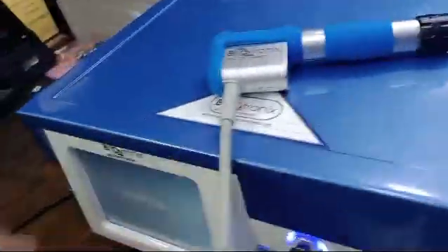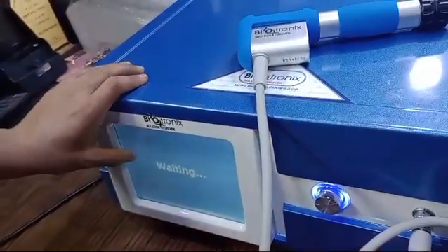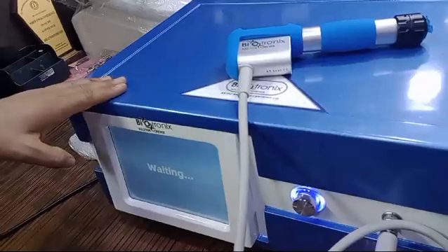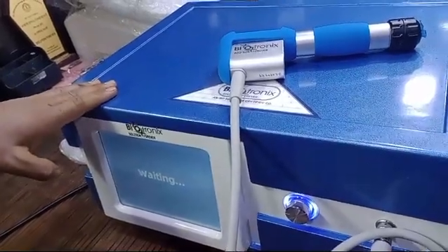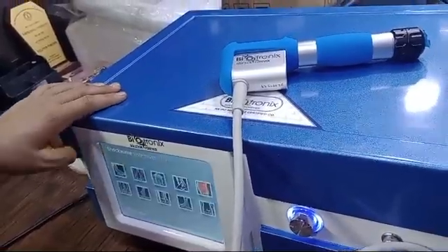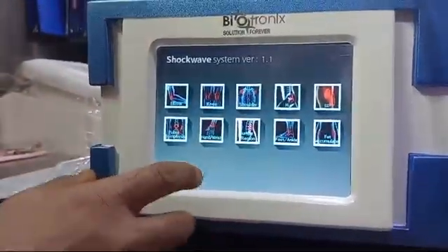You can see this is the touch panel, and it's showing you waiting. The machine is getting started, the compression is starting. You have to press the screen, and it will start, and you will see that there are 10 treatment areas over here.